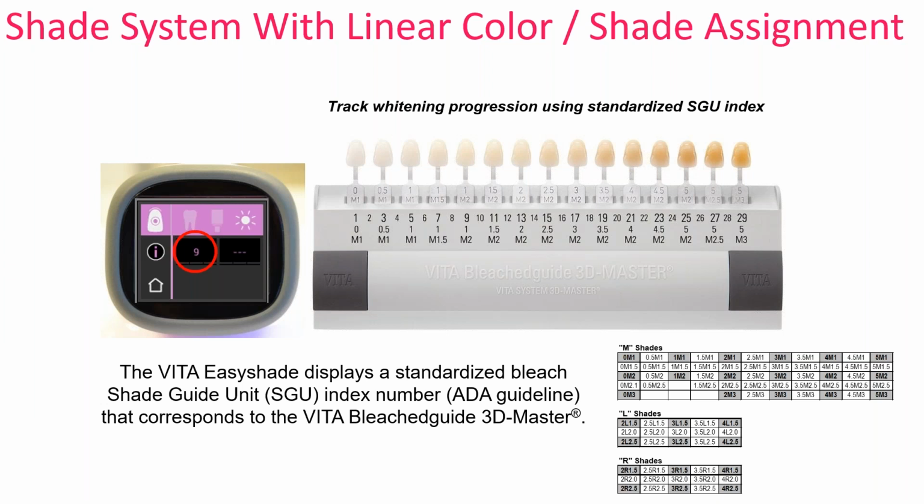It's difficult to say, I shifted your shade 5 shades, from A4 to A2. I demonstrated how they're not linear. They're all over the place. So the shifting is not as accurate as something like 3D Master. So this is the ideal shade system for bleaching.